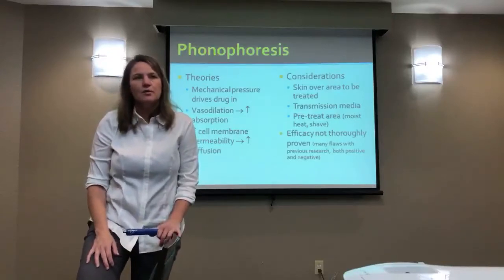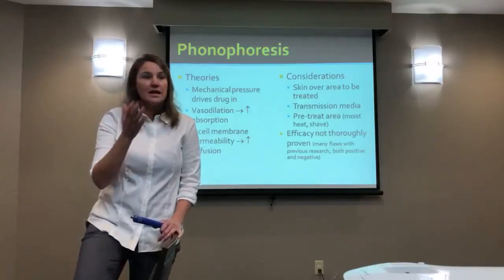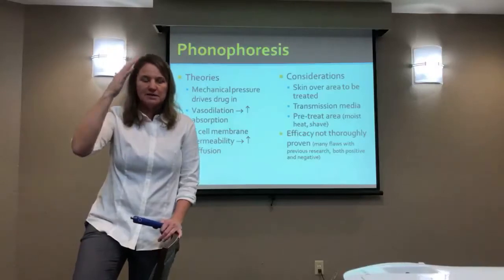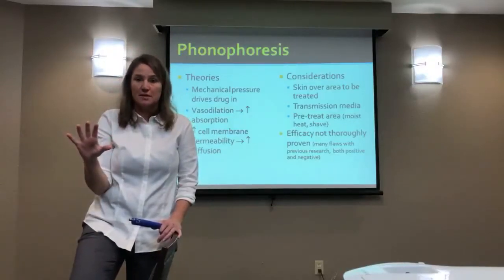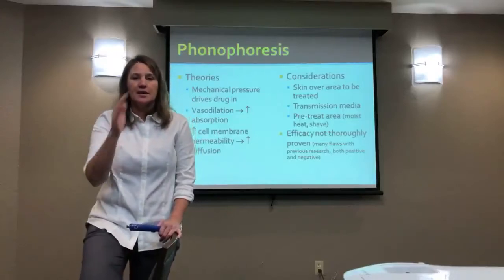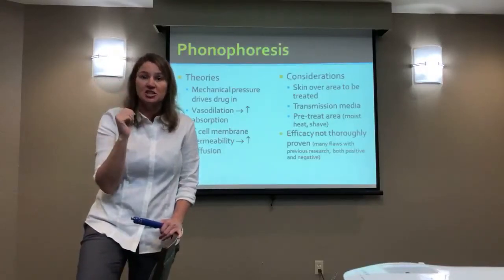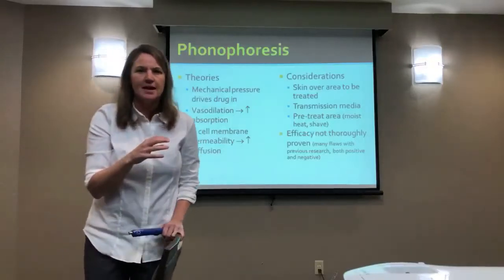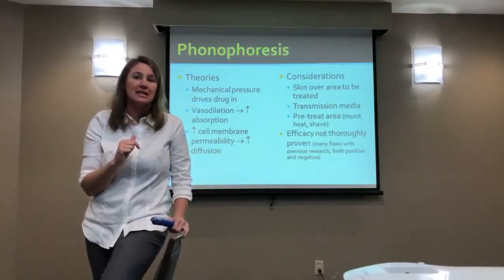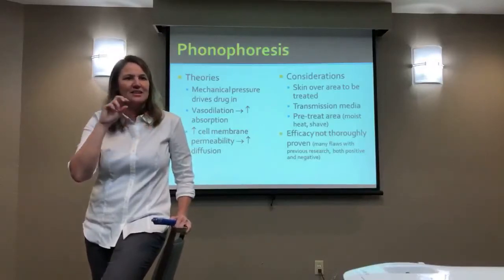To me, this is a really good debate to have. We just talked about how ultrasound is more pro-inflammatory. There was a really interesting study that basically said everything we're doing is not proven. All these ultrasound treatments from a non-thermal perspective, there's no evidence for them. The evidence is so weak. They had done a survey and all these therapists were using it for inflammatory conditions. And the criticism of it was, well, it's not an anti-inflammatory. But I think most of us would agree that a lot of the patients that come to us don't necessarily need an anti-inflammatory. Instead of itis, it's osis. You know what I mean? They have tendinosis instead of tendinitis.